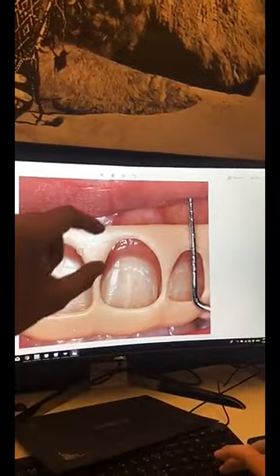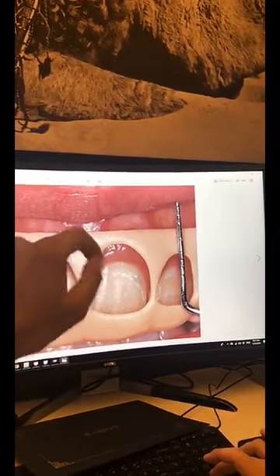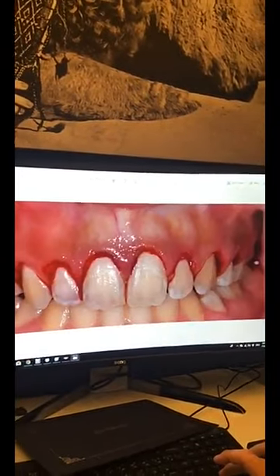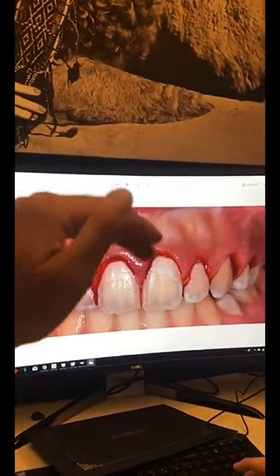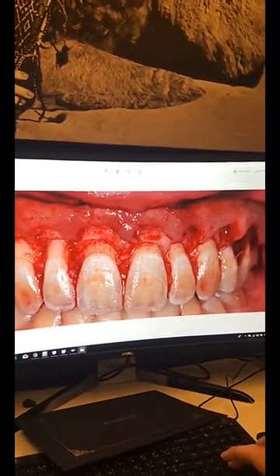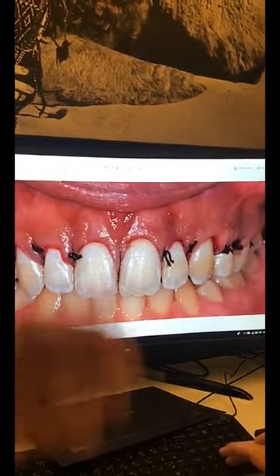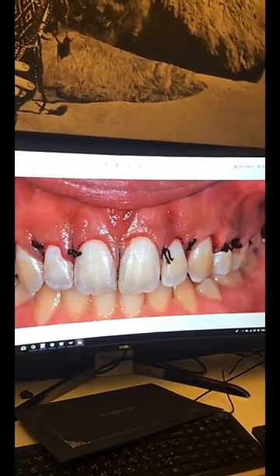The exact measurement is the upper margin of this window. That's exactly where the perio surgeon will remove the gingiva. And we can see that this is precisely excised gingiva. Later on, an osseous resection is performed, followed by sutures after the osseous recontouring has been completed.